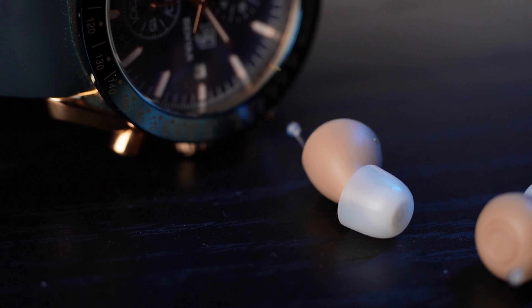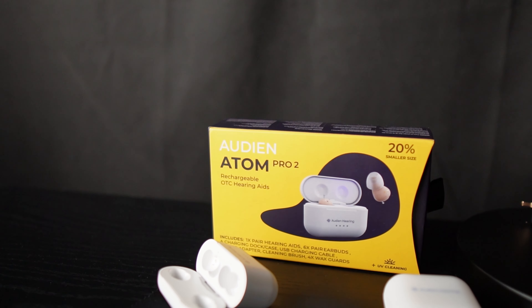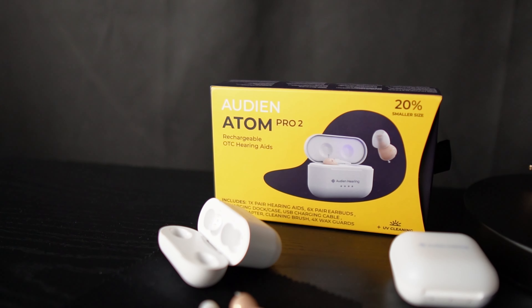I'm going to go over all the different features and also look at how close these are to prescription hearing aids using my new prescription hearing aid feature chart. Check out my over-the-counter hearing aid buying guide for more detail on how and why I developed that system. We'll also talk about price per point — basically how much money you're paying per feature that these share with prescription hearing aids. So let's dive in and see what the Atom 2 and Atom Pro 2 have to offer.